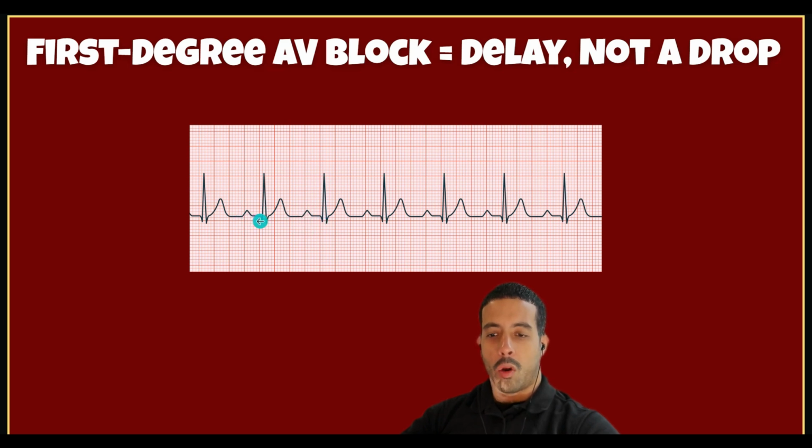Notice how long it is here, how long it is here, but it's normal. It's not abnormal, and that is one of the only things that could be mentioned here. So that leads me to think there's a delay and not a drop in the beat. That leads me to know that this is definitely not a 2nd degree or a 3rd degree heart block. But what I do see is somewhat of a partial block, which is most likely benign. Benign means that there's no symptoms related to this.